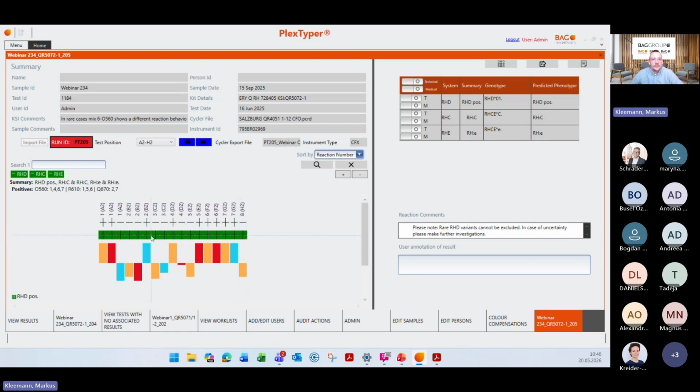Otherwise, if you can see here a minus and the background is colorless, then it is an indication that something was wrong with the PCR, or that you basically forgot to pipette it in this well. So whenever you see this green bar here with these pluses, then this is a good indication that your PCR was running correctly, and that the internal amplification control occurs correct.